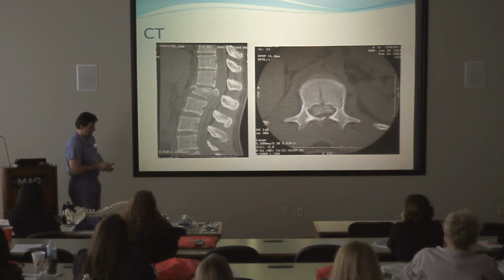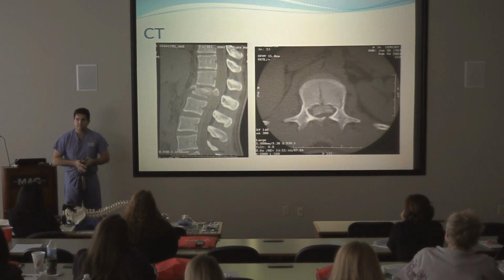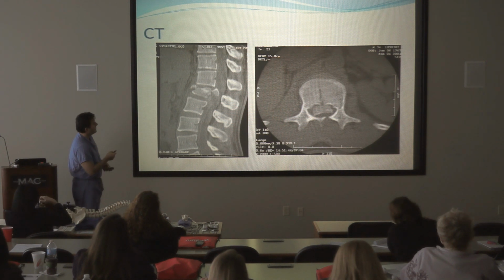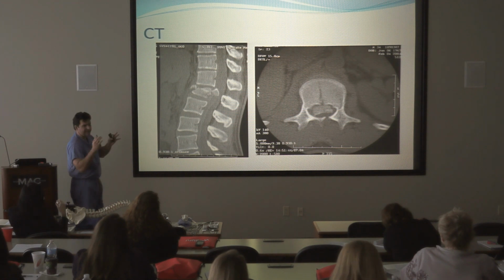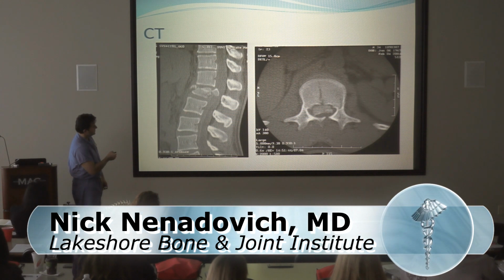Here's a CT scan. In addition, a part I forgot to tell you is it works like a bread slicer. So there are vertical slices it's taking through you and then horizontal slices through you, so you can get better details as far as looking at those fine cuts. Now you can clearly see the bones very, very clear. They're not this hazy whitish fog that you see on an x-ray. You can actually make out the distinct borders.